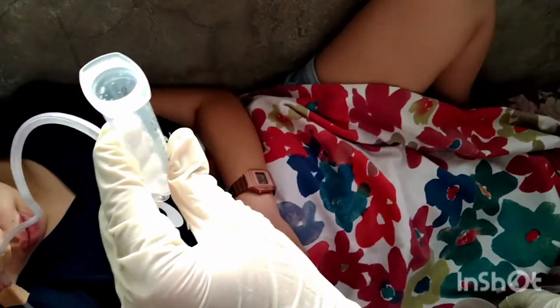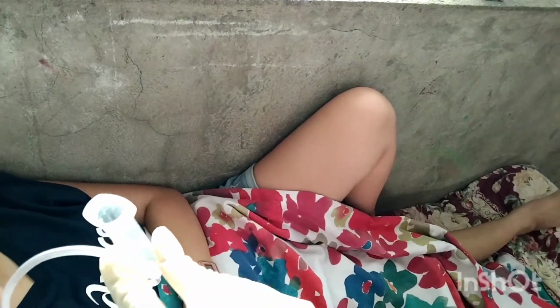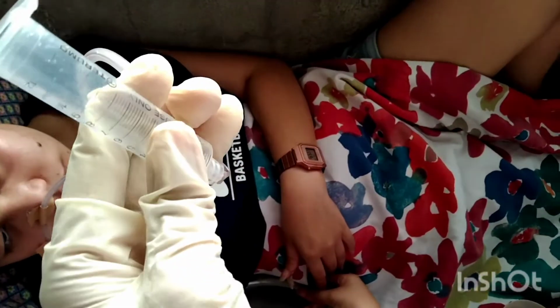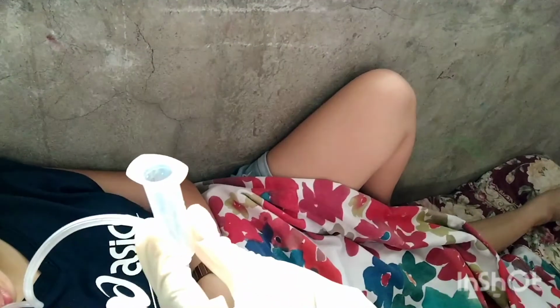Next is advance tube feeding gradually. Tube feeding should be advanced gradually to prevent diarrhea and gastric intolerance to formula. When tube feedings are not being administered, cap or clamp the proximal end of the feeding tube. This prevents air from entering stomach between feedings.